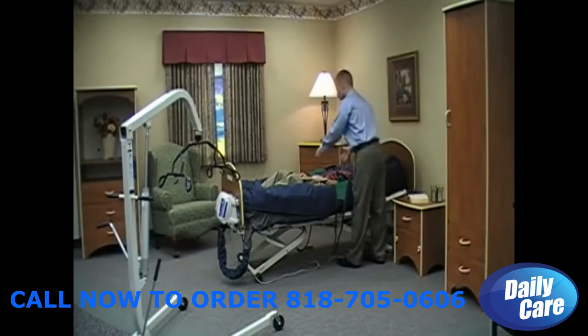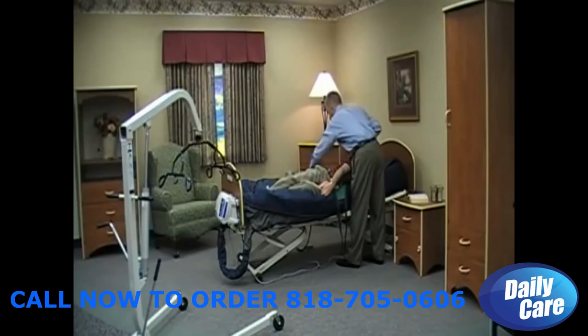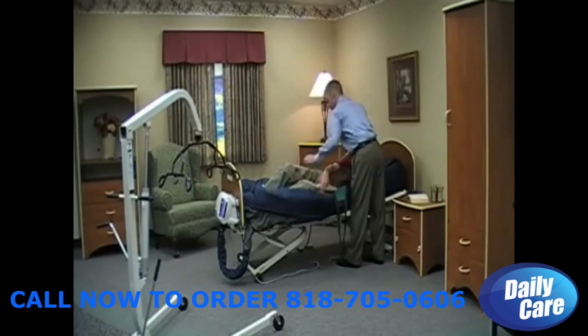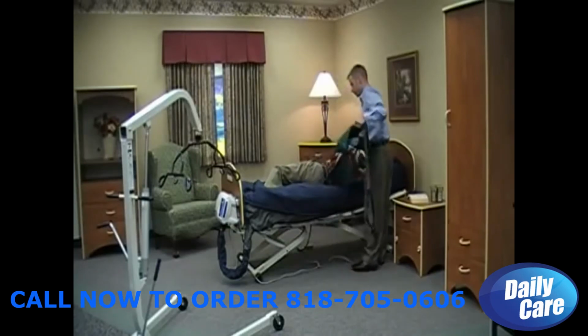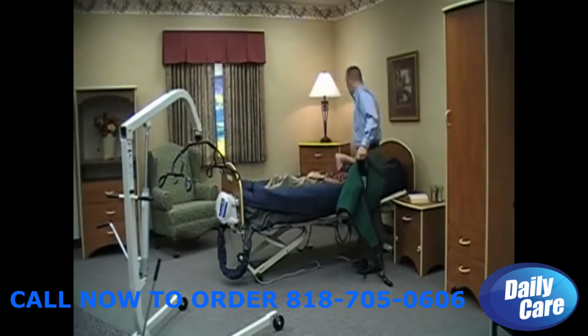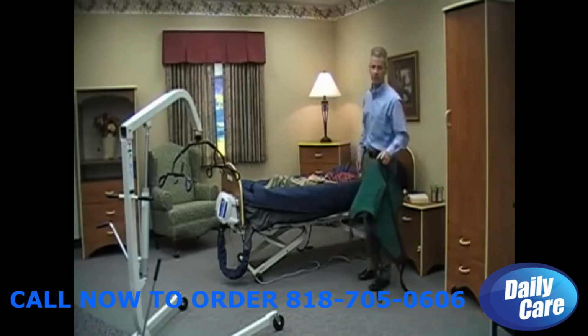If I have a partner, I can roll the resident to me, tuck the top half underneath, roll the resident away from me, and remove the sling. Ensure that the resident is comfortable and in the appropriate position, and then we can go on to our next task. Thank you.